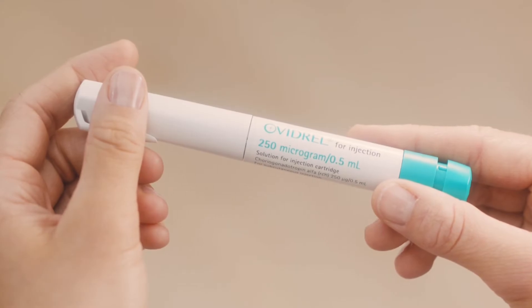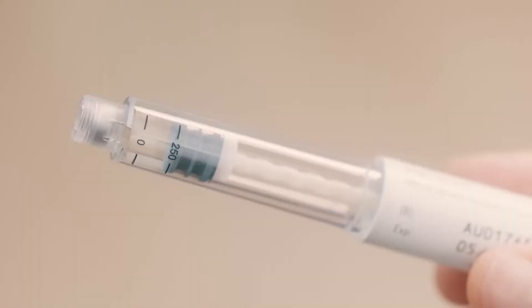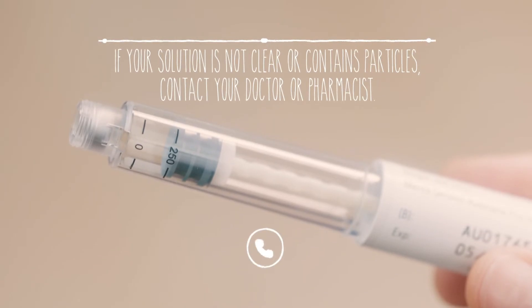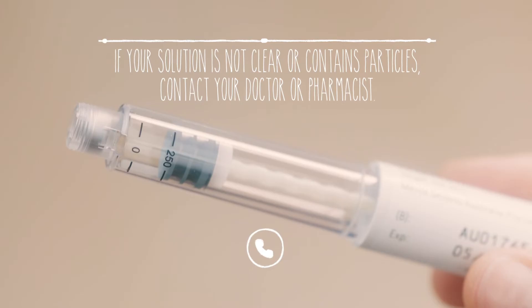Before you use the pen, take the pen cap off so you can take a close look at the solution in the drug reservoir. The solution should be clear with no particles in it. You must only use Ovidrel if the solution is clear and free of particles. If the solution isn't clear and particle free, speak to your doctor, nurse or pharmacist to get a new pen. Okay, so mine looks fine.